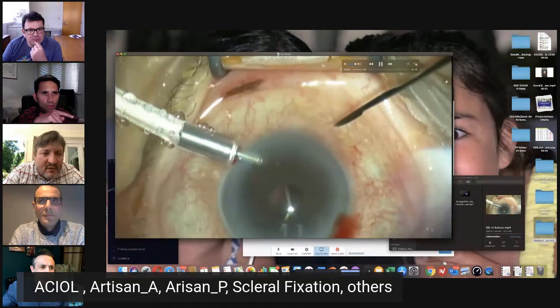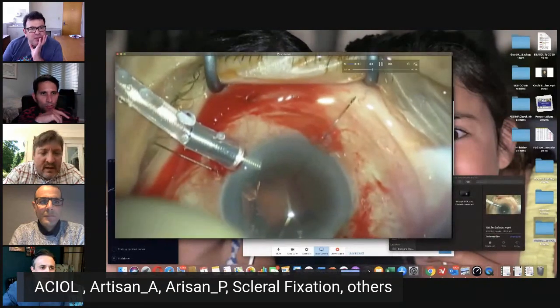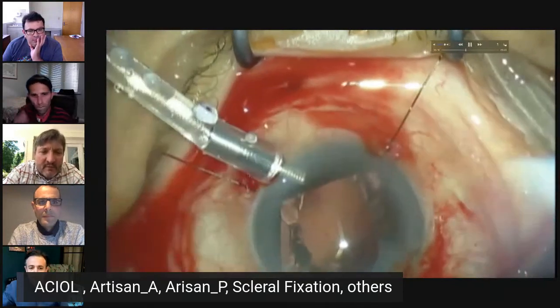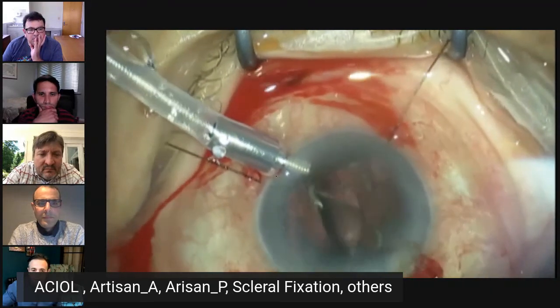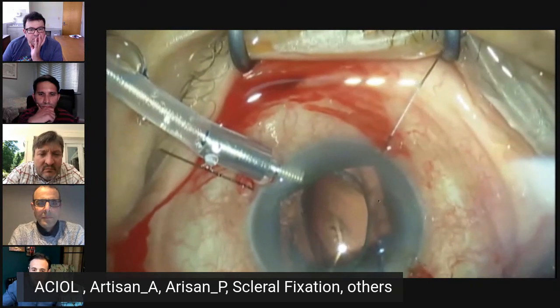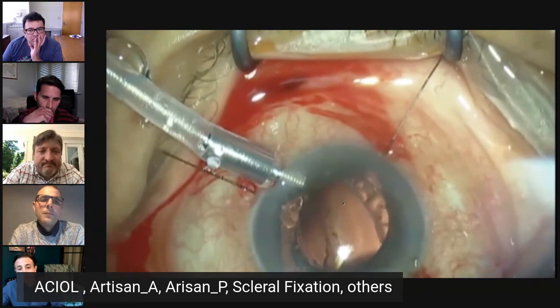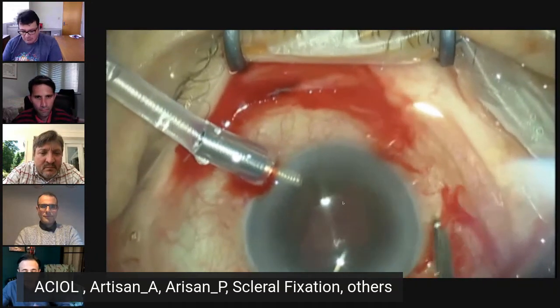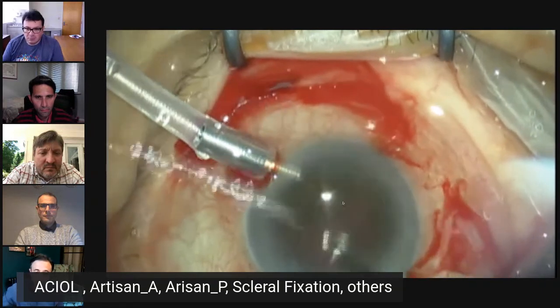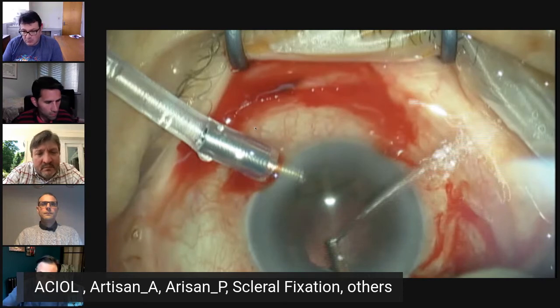Yes. So I'm doing hooks here. As you can see, this is a patient that was sent to me to put a retropupillary lens in, and when I enlarged the pupil, he had enough capsular support to be able to put a sulcus lens. So I just wanted to show this to remind people that this is an option that we should explore before starting to clip anything to the iris or the sclera, which is basically one of the most anatomical options after a posterior capsule intraocular lens.